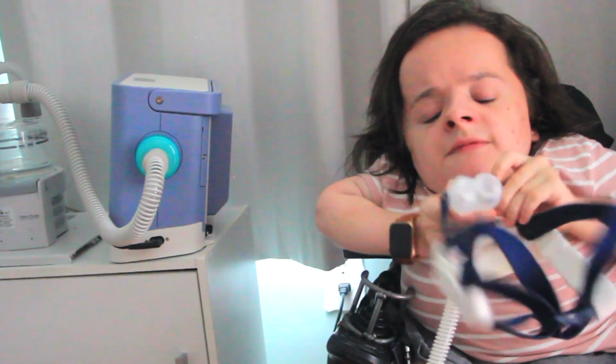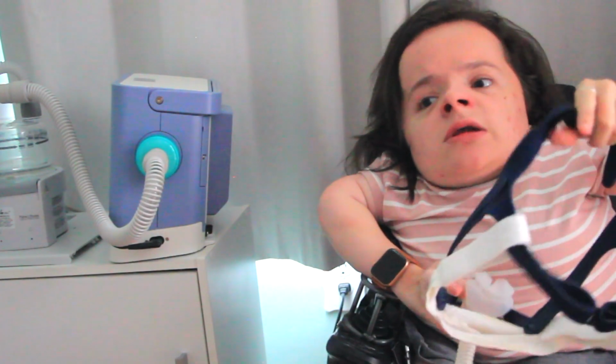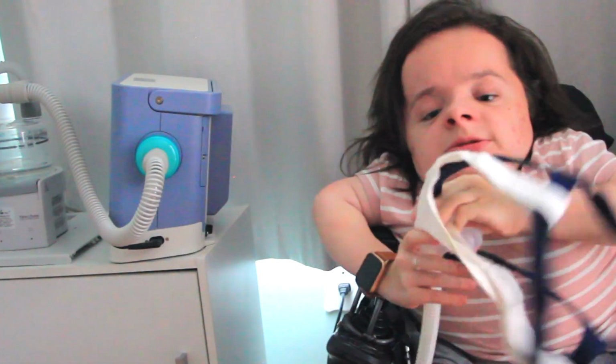The kind that I have is called nasal pillow. It's the only kind I can tolerate. It's very non-invasive and it's easier to talk with that on too. And then this is the tubing.